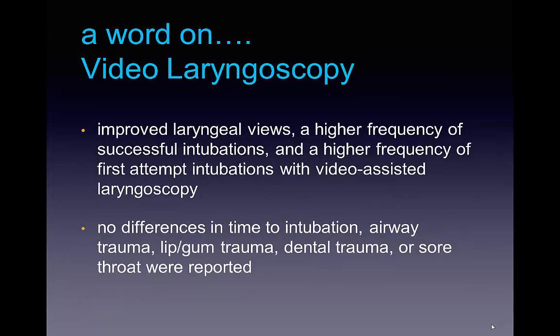What is important to note, however, as we've alluded to earlier, is that in cases where there are a lot of other things in the airway, such as secretions or blood, sometimes these things can very quickly obscure the view from the video laryngoscope, in which case it becomes a useless device, and in that case, sometimes direct is actually better.